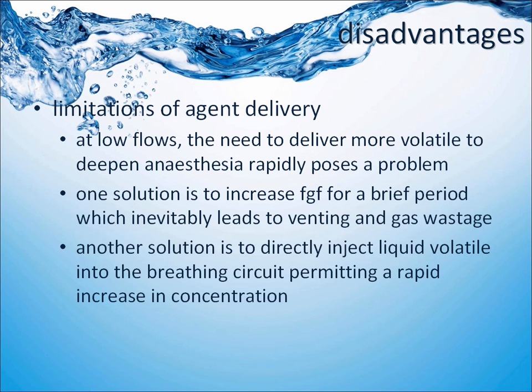If you need to increase the depth of anesthesia rapidly, you can't just turn up to 8 and expect a rapid increase in the agent delivery, because your fresh gas flow rate is still quite low. So one of the solutions is basically to increase your fresh gas flow rate momentarily for about 5 minutes or so, and then decrease it again.